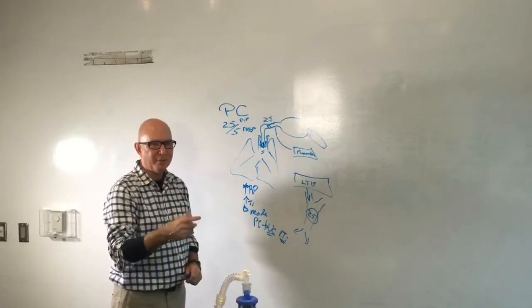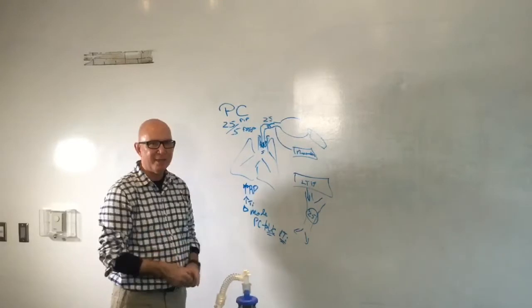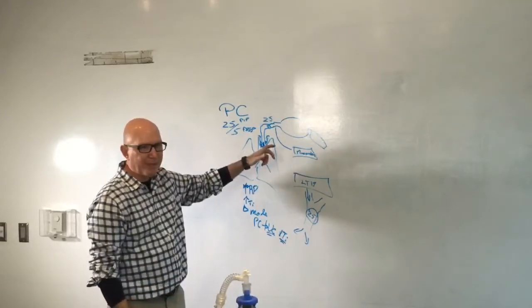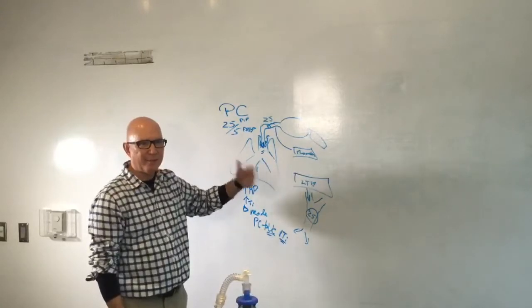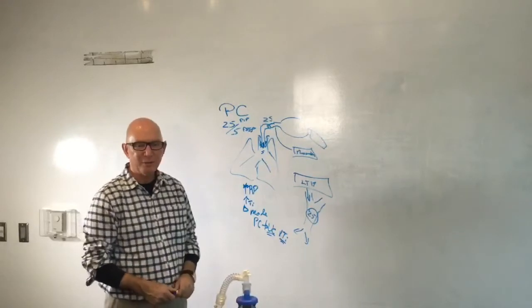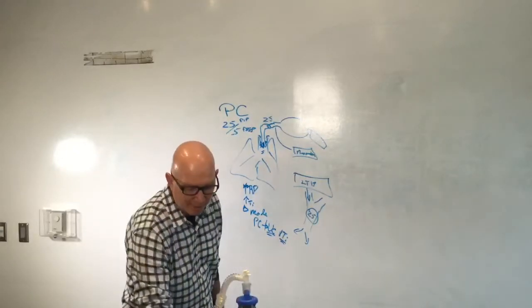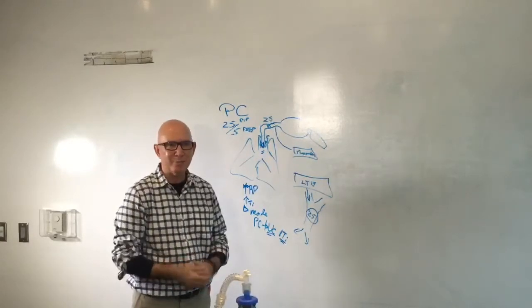And even 2 or 3 centimeters of water one way or the other is going to change the tidal volume, especially if you're talking about tidal volumes of 50 or 60 mils. And so in that regard, we want to be sure that with the T-piece resuscitator, we can give some consistency. That's simply the limitation of transport ventilation when we have one single machine, which is very good in what it does, but in some of these situations it just doesn't have the ability to make changes. Okay.